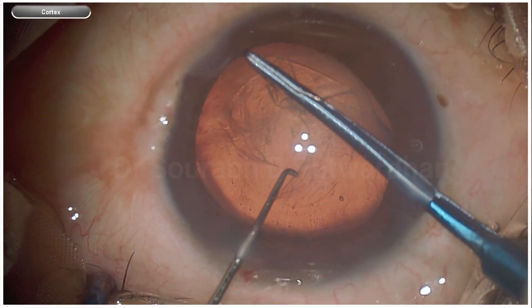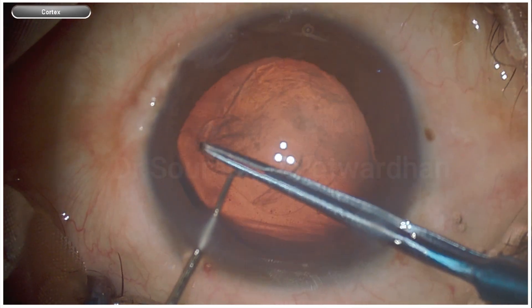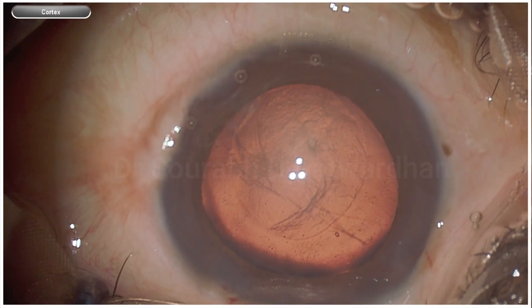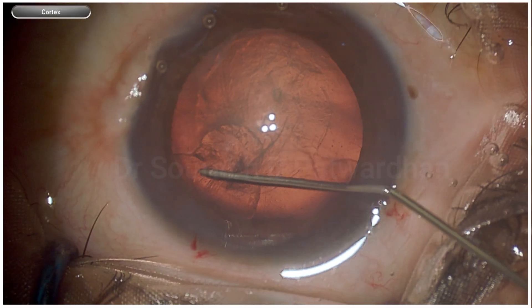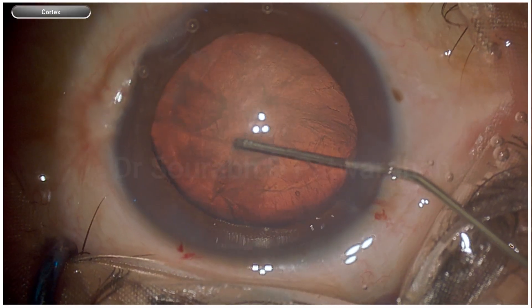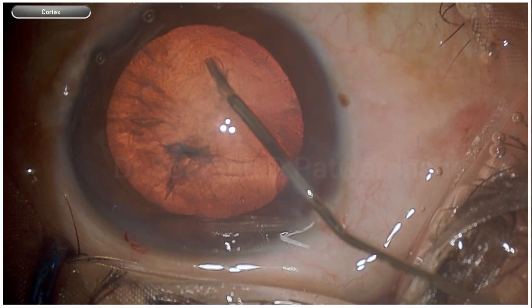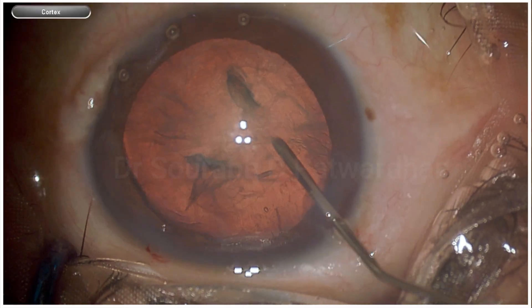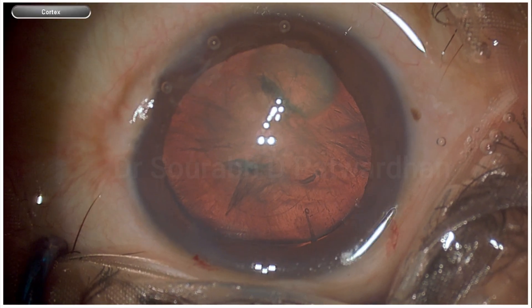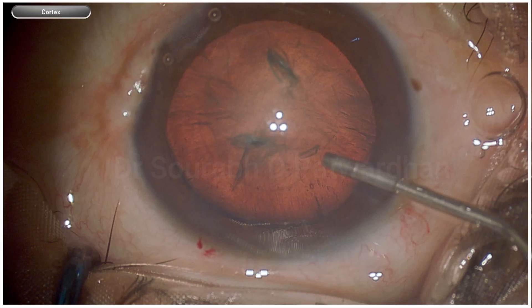So you can kind of map the extent of subluxation. As I go around, you can see there is good counter traction by the inferior zonules. I can safely say the inferior zonules are good, but superiorly, probably around 4 clock hours, the zonules are broken. When I asked the patient on the table, he told that a couple of years back he had a trauma with a ball. So this is a post-traumatic subluxation, and the extent is probably around 4 clock hours.